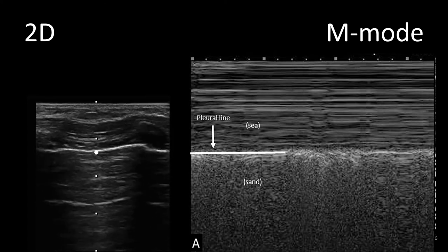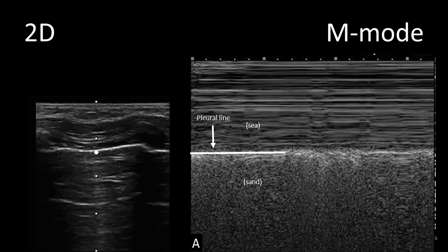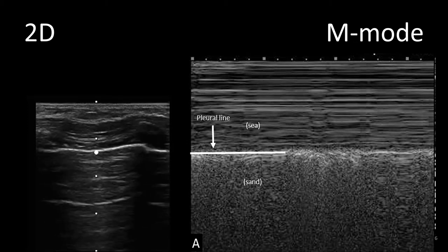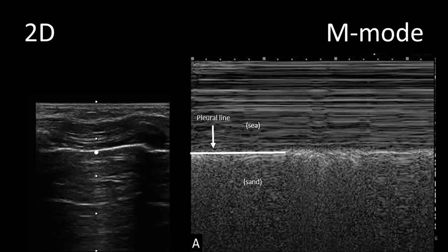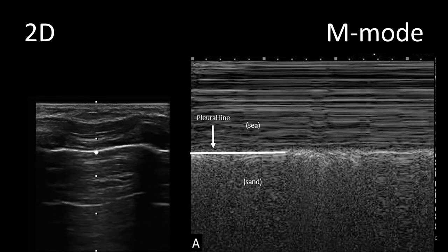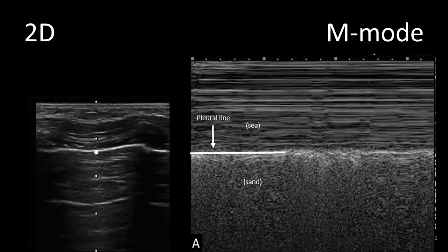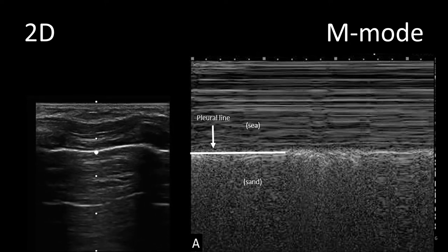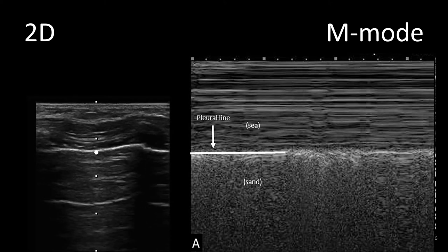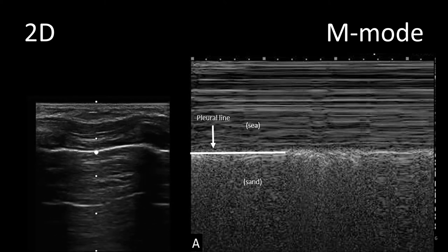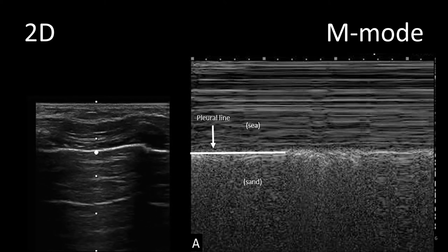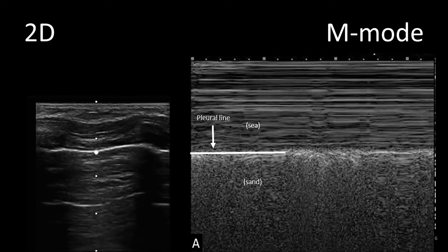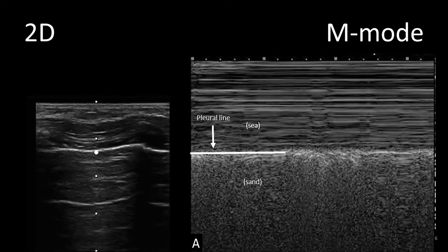The structures above the pleural line are the skin and soft tissue of the thoracic wall, which appear as a collection of straight horizontal lines because they are not moving at all. In M-mode, structures that are not moving will appear as straight horizontal lines. Right below the pleural line we have the visceral pleura and the lung showing a myriad of points creating a granular appearance as a result of the motion of the lung. More on this in the lung ultrasound lectures — you don't want to miss that.